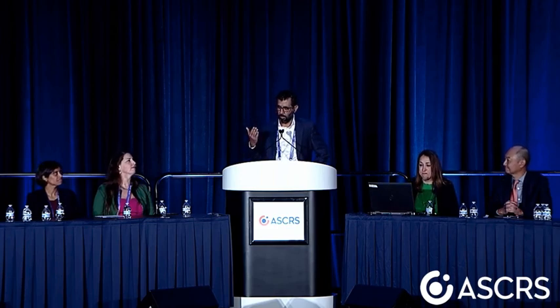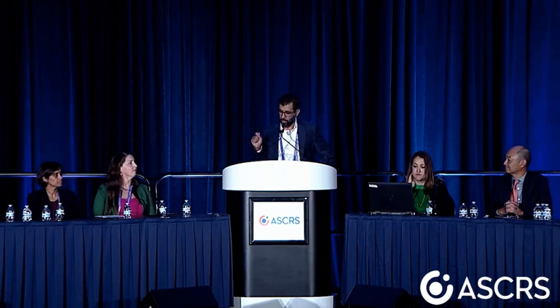What happens if you get a curl in the graft? Great question. Sometimes if you go in the wrong spot, you'll get a fold in the graft. If the fold is peripheral, I say leave it alone. I don't think it's worthwhile to go in and try to evacuate the air, fill it with BSS, and then redo it. If the fold is central, you have to go in, remove the air, fill with a little BSS, sometimes massage it a little bit, and then go in again and place your air.